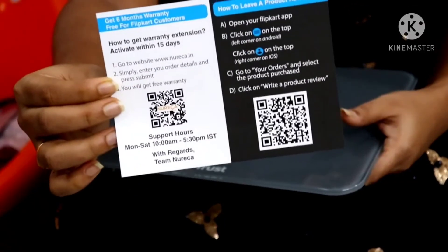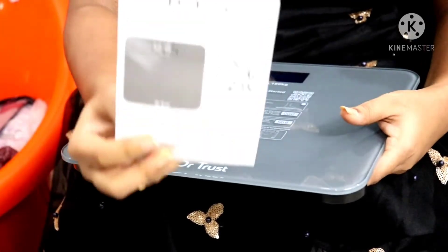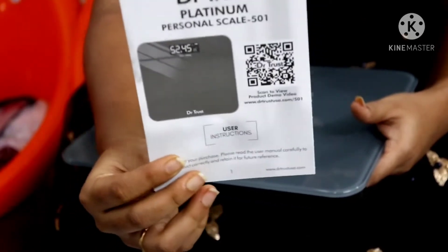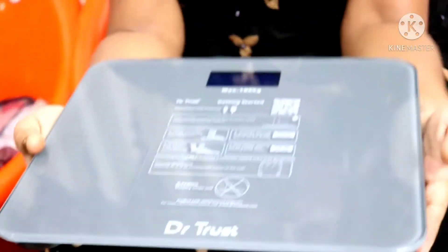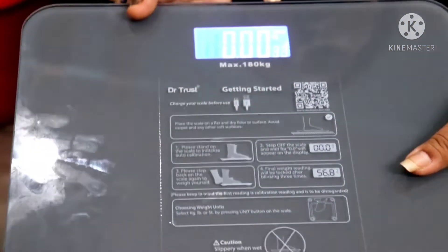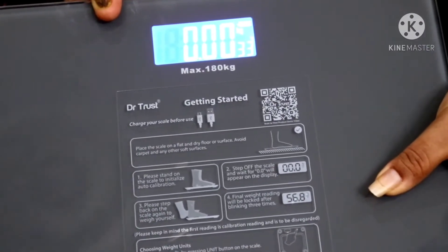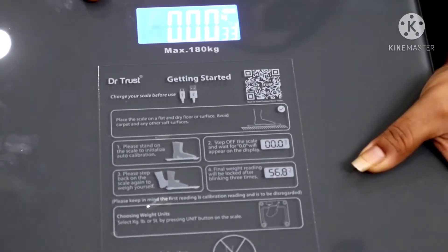They have the warranty card. This is the user manual. You can use the warranty card. So this is the weight machine. Now I press the button — it's in kg. So this is in lbs. I press the same button to switch units.